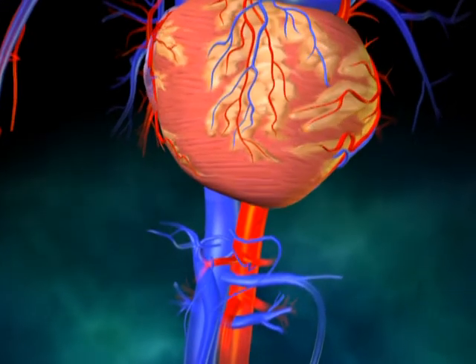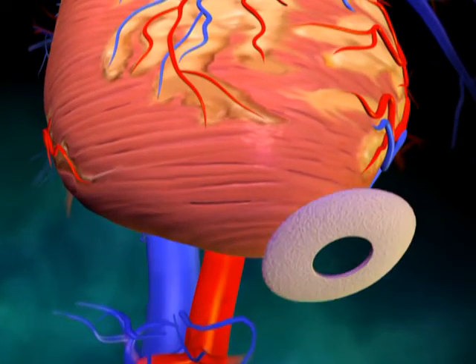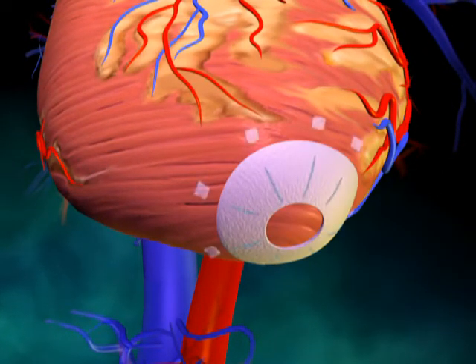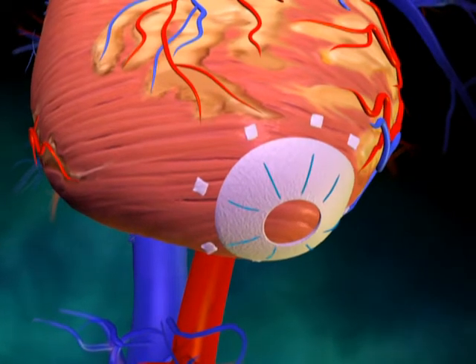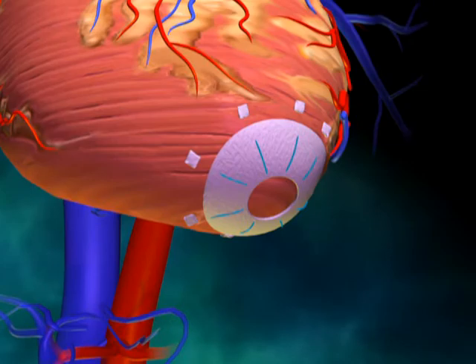Once the patient has been successfully placed on cardiopulmonary bypass, an apical fixation ring is sewn into the left ventricle with 8 to 12 interrupted 2-0 Prolene mattress sutures with large Teflon pledgets.